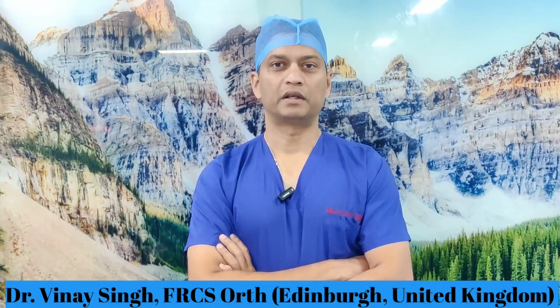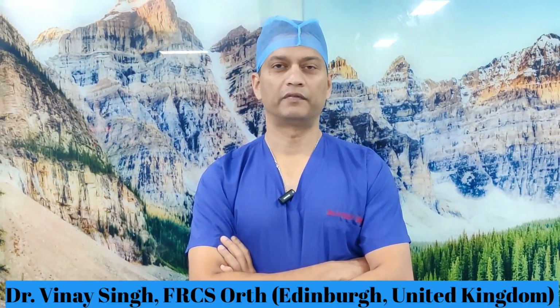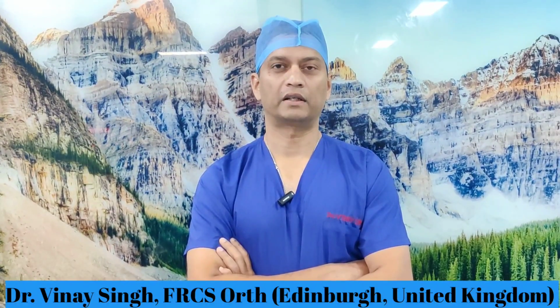Hello guys, today I am going to take you through a small procedure in which I am going to transfix a fifth metacarpal fracture with a fourth metacarpal. A lot of times we do intramedullary wires for a fifth metacarpal fracture. Now this is a slightly oblique fracture and there is a lot of shortening. So today I am going to show you how to address these fractures with 2 K-wires transfixing the fifth metacarpal with the fourth metacarpal in a safe way.